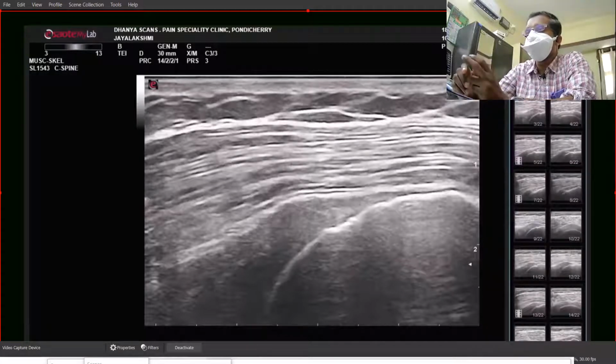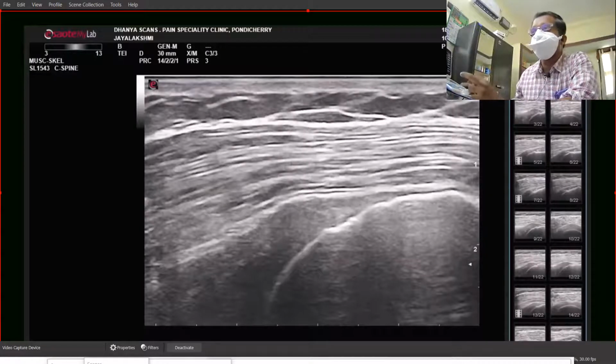Okay. So, as usual, going for the ultrasound examination of the shoulder, the supraspinatus was looking a little bit thinned out, in the sense there was a significant volume loss at its insertion onto the greater tuberosity. That means there could possibly be a partial or full thickness tear, or sometimes, for your surprise, it could be a complete tear of the supraspinatus. That is always a possibility, right?